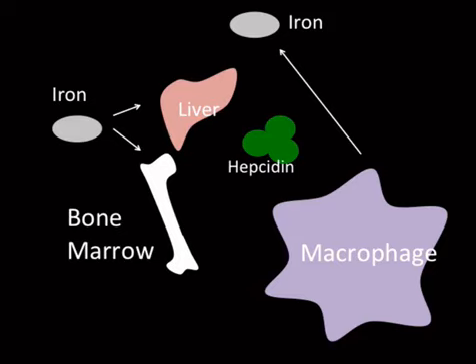Back in the Cretaceous period, this was the gold standard for cancer staging. Now we have a thing called FDG-PET. But I should point out that gallium can also bind to neutrophil membranes even after the cells are dead, which gives it some advantage over indium for white blood cell imaging, especially in a setting of chronic inflammation. So the take-home is gallium is iron, basically, and it's a nonspecific inflammation, infection, rapid cell division marker.